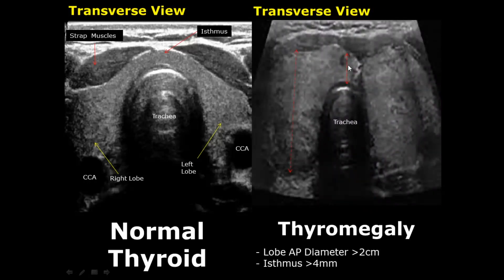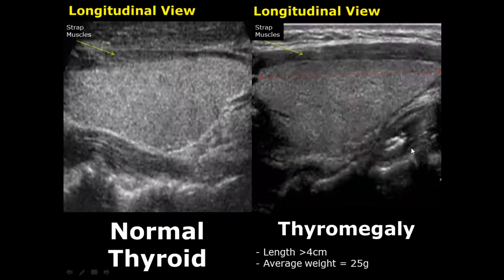We start off with thyromegaly, which is the enlargement of the thyroid gland. When the AP diameter is more than two centimeters and the isthmus is more than four millimeters, this is suggestive of thyromegaly. In the longitudinal view, we can measure the length of the thyroid gland; the normal value is around four centimeters. If it is more than four centimeters, it can be a signal of thyromegaly. The average weight of the thyroid gland is around 25 grams.